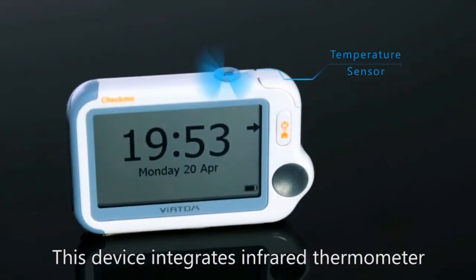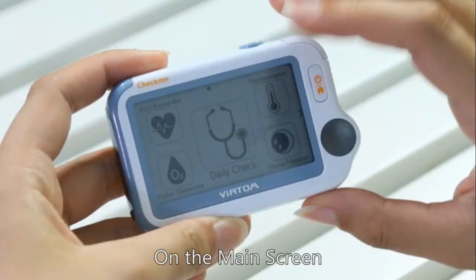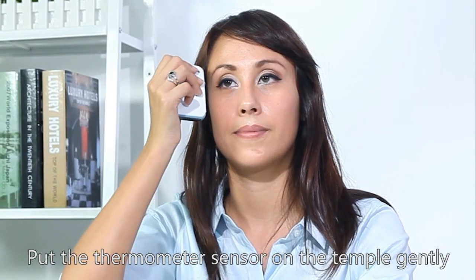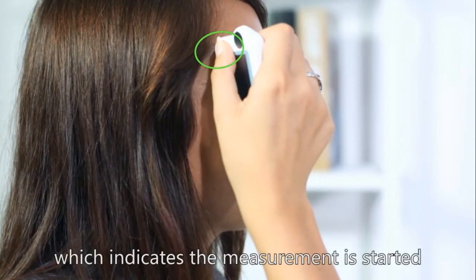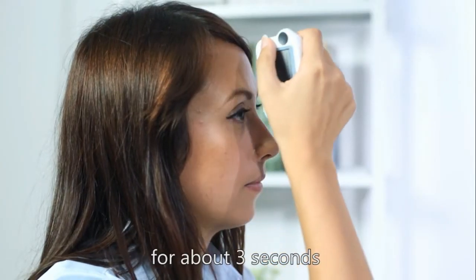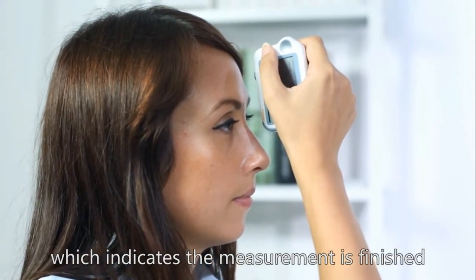This device uses an infrared thermometer to measure forehead temperature. On the main screen, select thermometer. Put the thermometer sensor on the temple gently and press the home button. You will hear beeps, which indicates the measurement has started. Move the device to your forehead for about three seconds until you hear a longer beep, which indicates the measurement is finished.